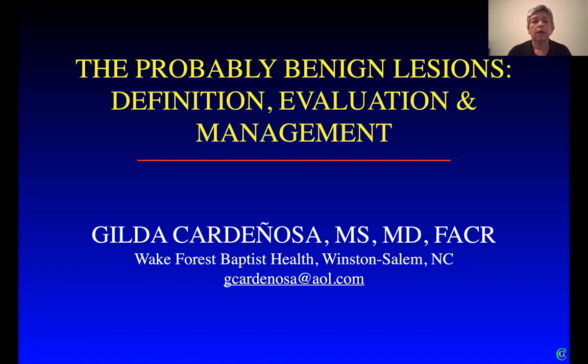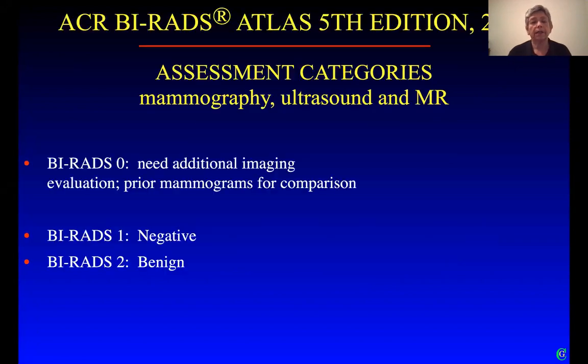My second topic with you this evening deals with the probably benign lesions, how they are defined, evaluated, and managed, and the data in support of this concept. If I again go back to the BI-RADS Atlas that I talked to you about earlier, the fifth edition published in 2013, there are assessment categories that are provided for mammographic studies, for ultrasound, and for breast MRI.